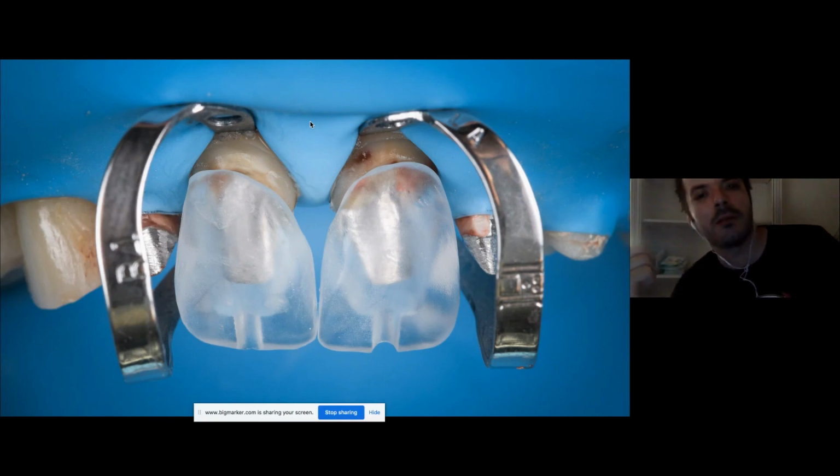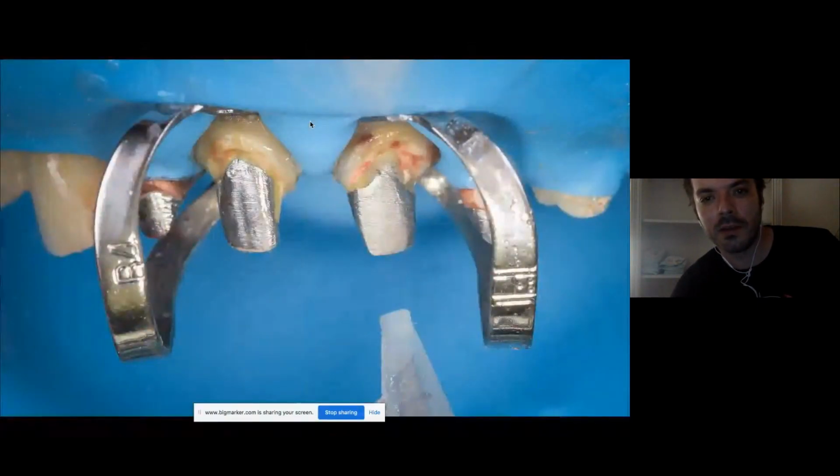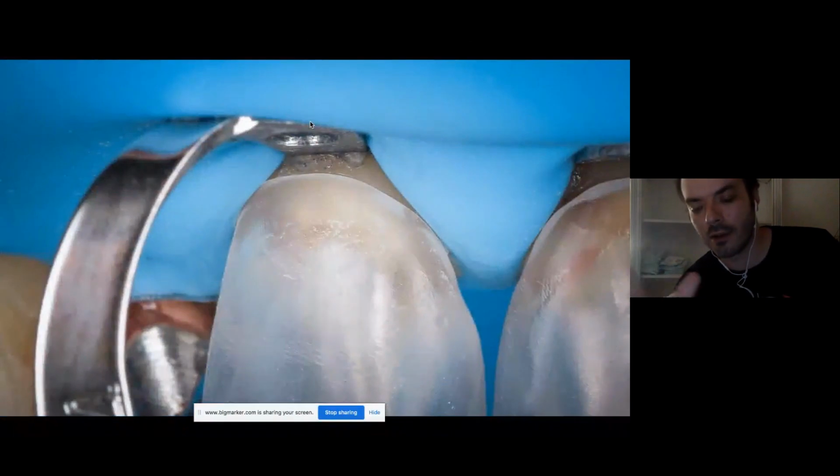There's nobody better in the world to design an abutment than a technician. No dentist is better than a technician in knowing where the space should be distributed properly. So here, because they have the tools virtually, they can do this. And you can see you have a very good fit for this.